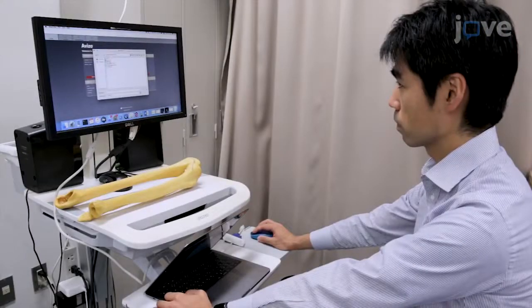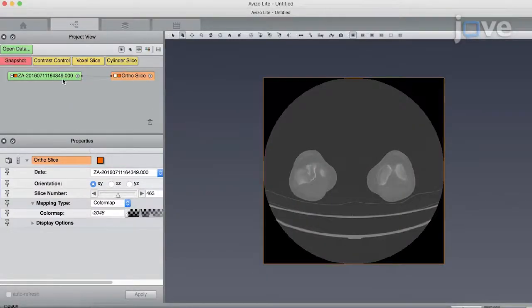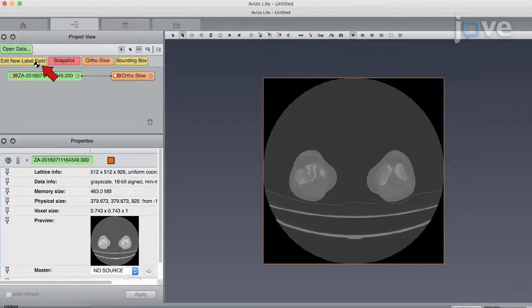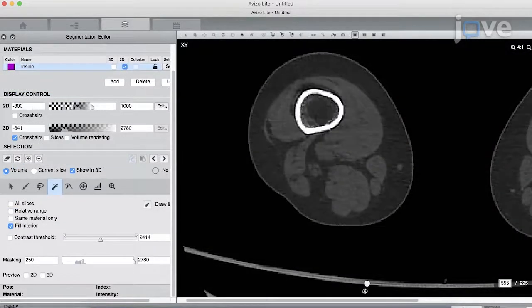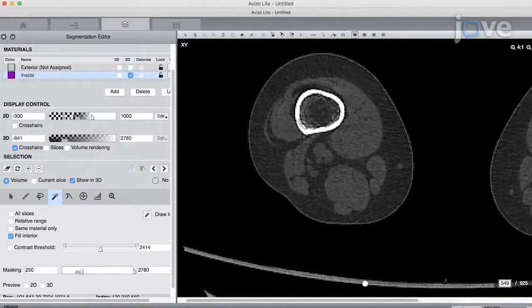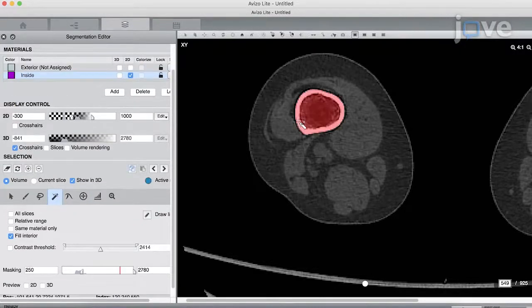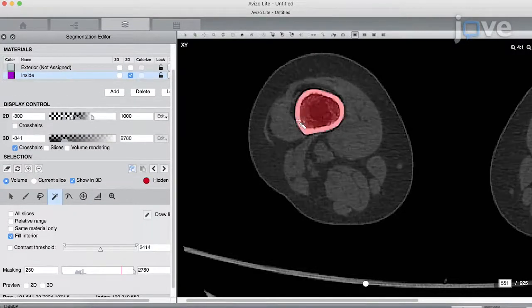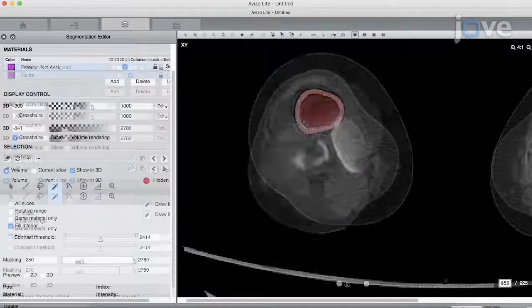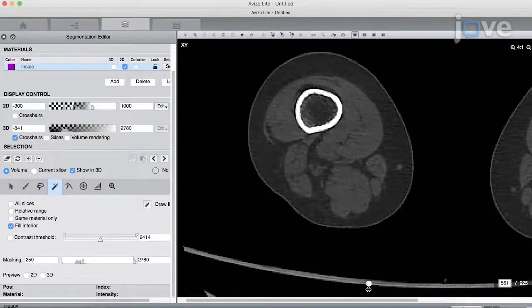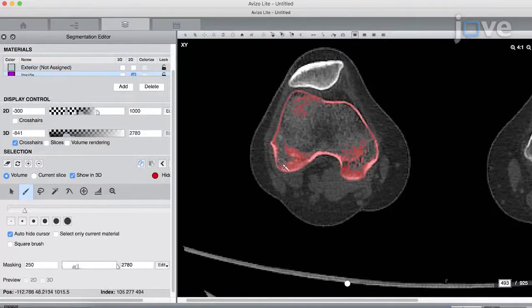For surface semi-automatic segmentation of the 3DCT data, load the CT DICOM data into the appropriate software and click Edit New Label Field to open the label field. Identify which threshold CT attenuation value is appropriate to extract cortical bone from the source bone and select materials with CT attenuation values above the threshold. Check the label for bone cortex selection and use an appropriate editing tool to manually modify the demarcation.